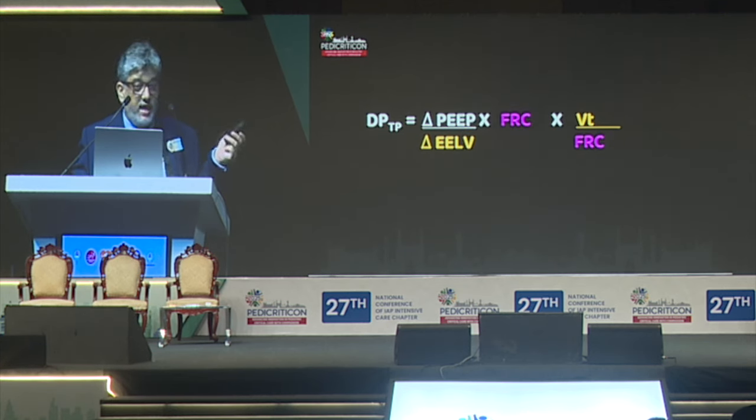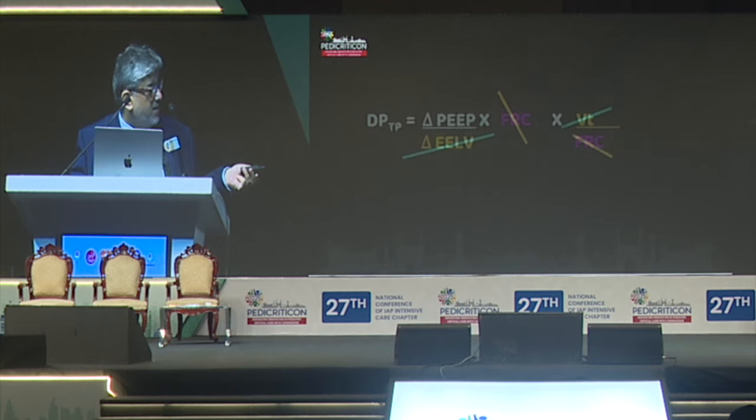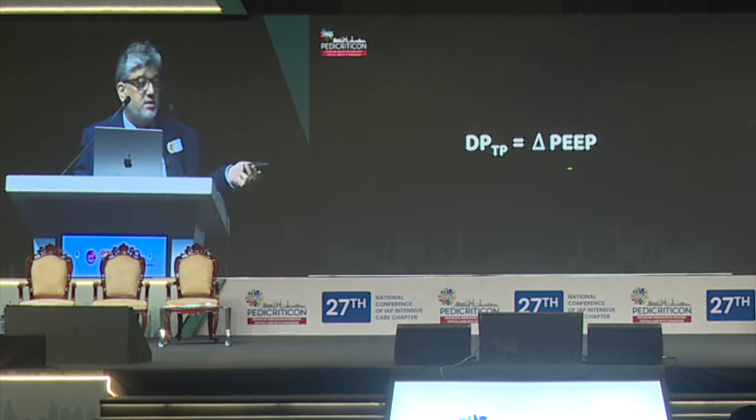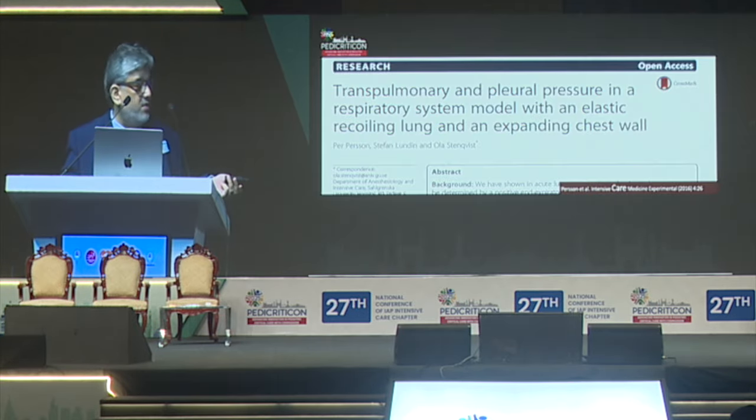And if you adjust your PEEP high in such a way that your tidal volume is equal to delta ELV, then even they will cancel each other. So now your FRC is also going to cancel, and mathematically you will have a transpulmonary pressure which is equal to the change in PEEP. This is how you can go for calculation of stress.